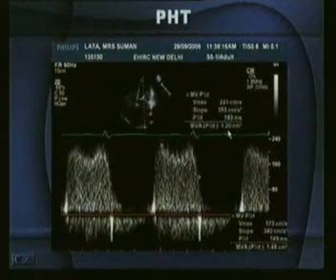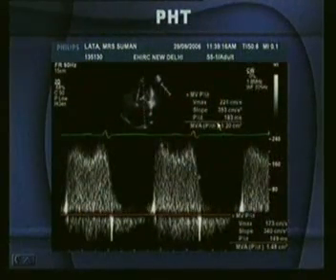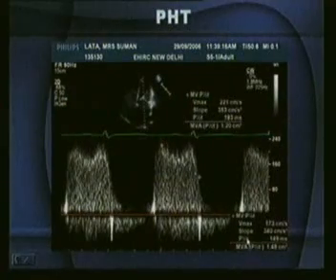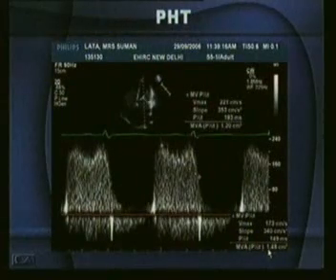So the mitral valve area is 1.2, right? This is not deep mathematics. The computer will give you, don't worry. But if you have positioned it here and then you take the beam up to this point, then as you will see in the lower part, the Vmax will be only 173, the pressure half time will be only 149, and you will get a valve area falsely of 1.48. So it's almost 1.5 centimeters.